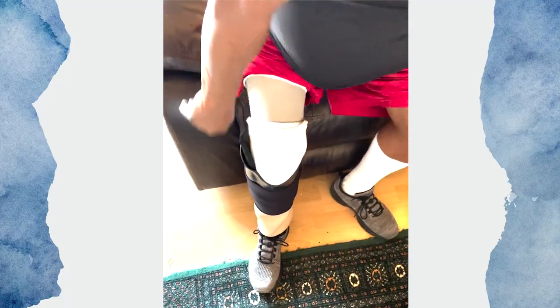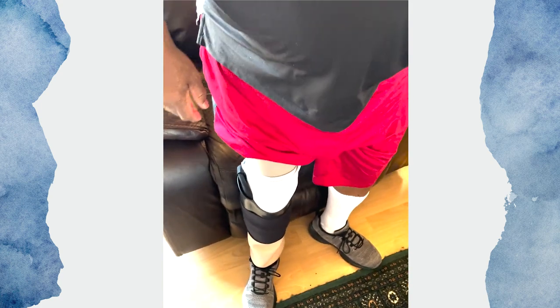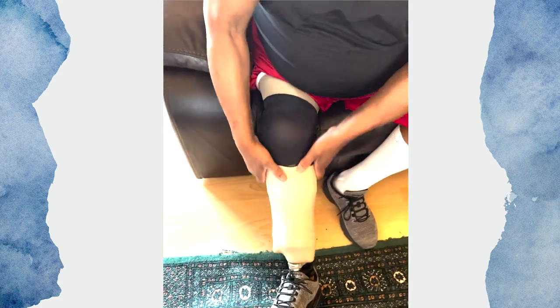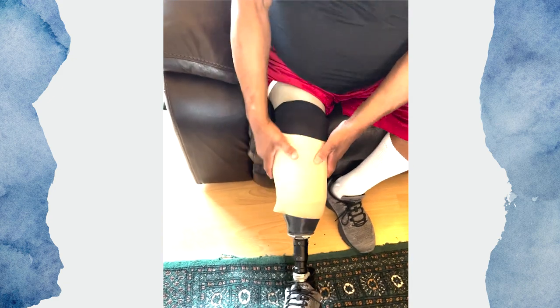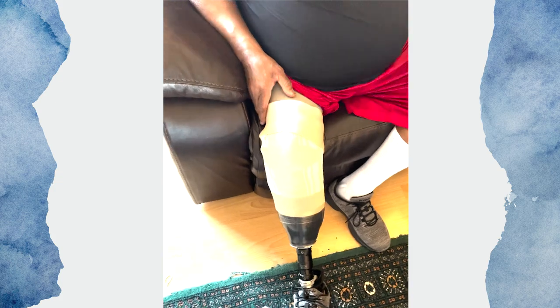For sleeve suspension, there is a sleeve that goes about mid-socket to upper thigh. There is also typically a one-way valve that lets air out as you push your limb into the socket. And once you get settled in, you can roll the sleeve up onto your thigh.